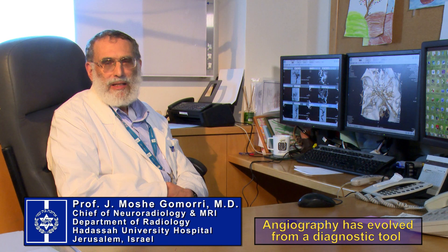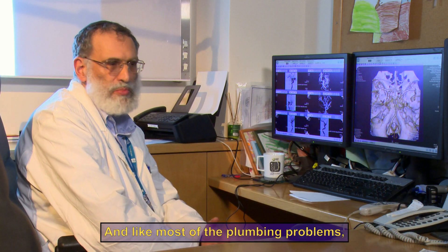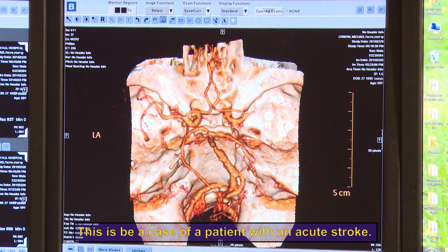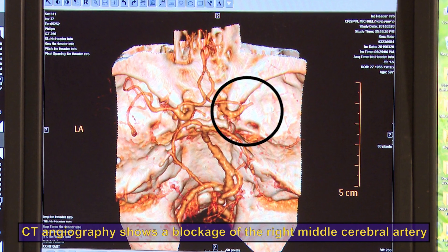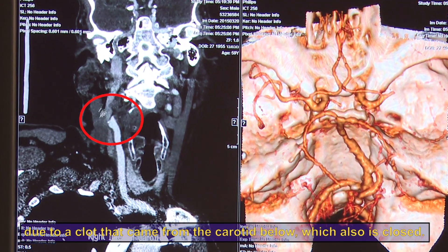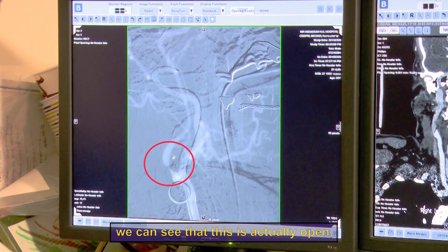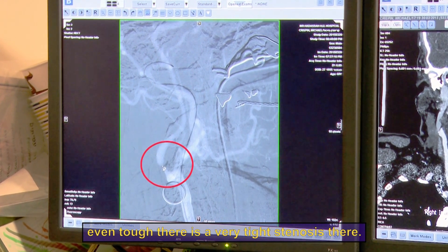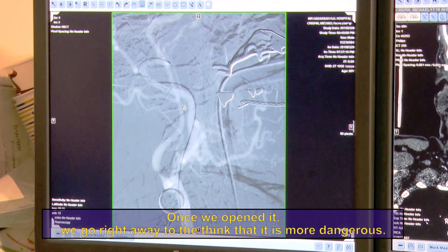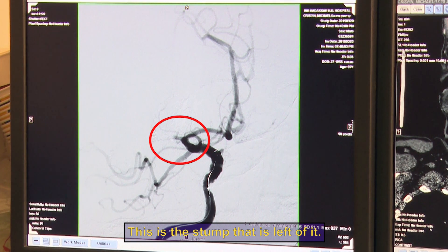Angiography has evolved from a diagnostic tool into a therapeutic tool as CT and MRI have taken over the diagnostic part. Like most plumbing problems, either something is blocked and you have to open it, or something is leaking and you have to close it. In this case of acute stroke, CT angiography shows a blockage of the right middle cerebral artery due to a clot from the carotid below, which is also closed. We have a time window — time is brain. In angiography we can see the stenosis and must open it before treating the clot above. We then see complete occlusion of the right middle cerebral artery; this is the stump that's left of it.